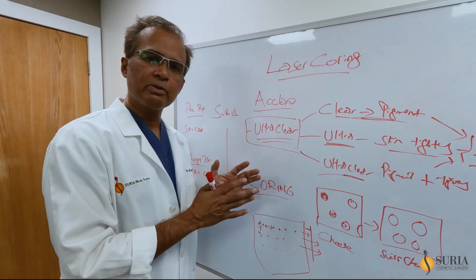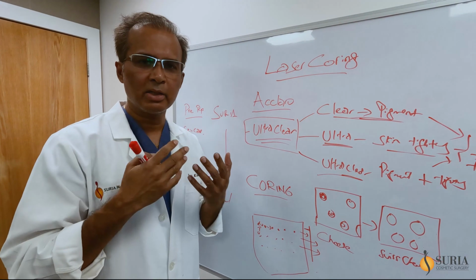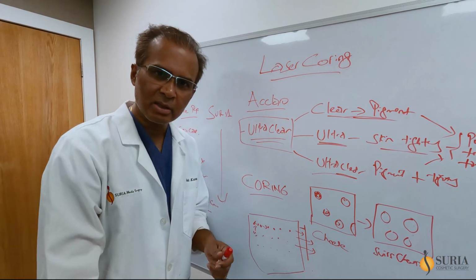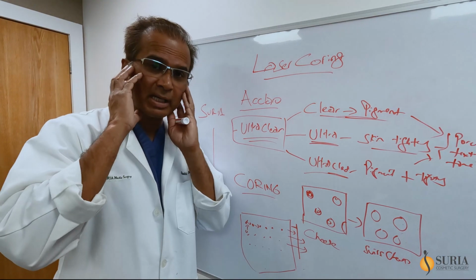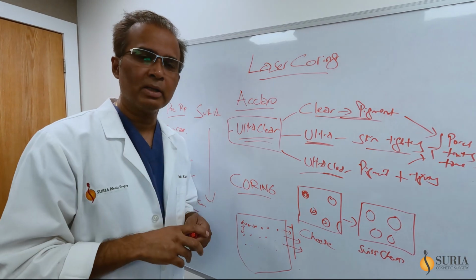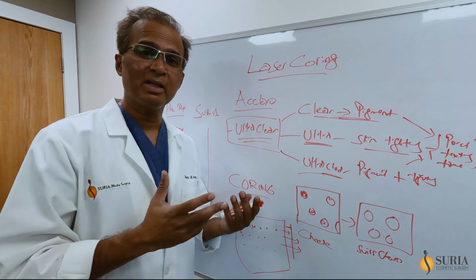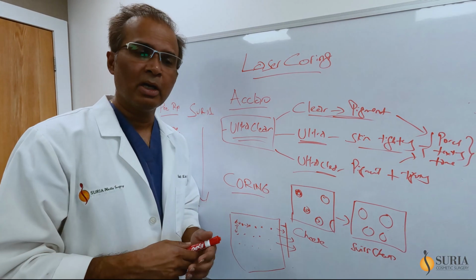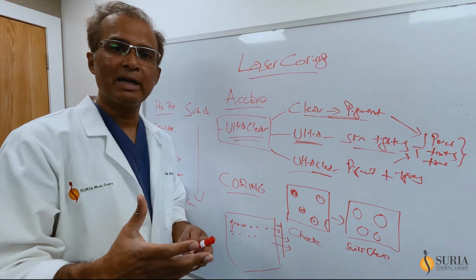And therefore, I do this for standalone patients who don't want surgery on the eyes, for example, or the neck and the chin area, or the cheek area, or the mouth area. You can do it obviously, maybe on the hands, the legs, etc. You could do it in combination with surgery. For example, if I do a lower face and neck lift, but the mouth has these deep vertical lines that are not so good looking, we can do it for that as well. If people do the face surgery but don't do the eye surgery, or sometimes people want even more improvement than the surgery could give, you can add this as an adjunct or an augmentation of the area in addition to surgery that can make it even better. Or maybe you could do it as a maintenance treatment 2-3 years after surgery to keep up with it.